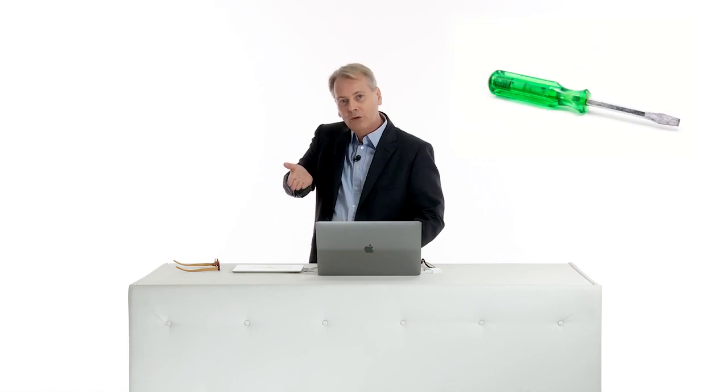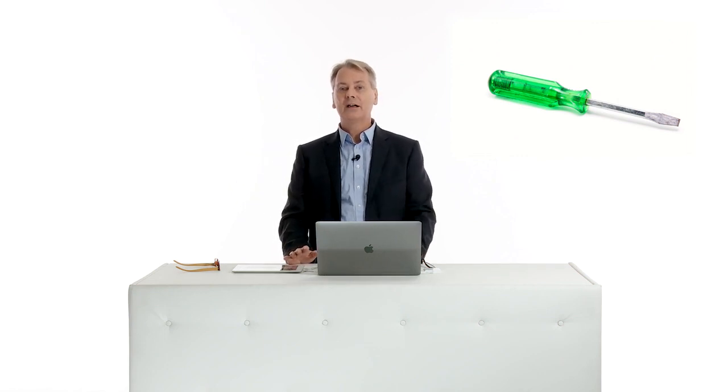There might be several situations where it is not so easy to really get a good subcostal view, especially if patients have tense abdominal muscles or if they have a little bit of a beer belly. Still, if you use the typical motion I showed you in the demonstration, where you kind of use a screwdriver motion, rotating towards the left and counterclockwise, and then of course adjusting the tilt so that you get into the IVC, I'm sure you will get a good view in most of your patients.